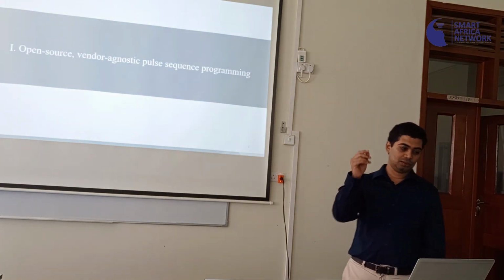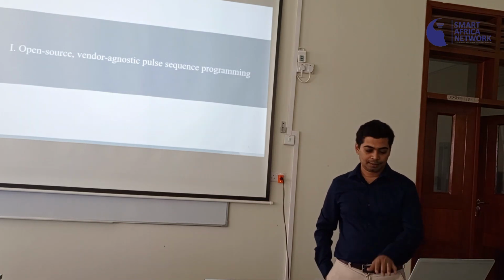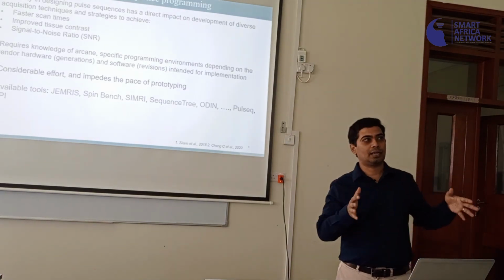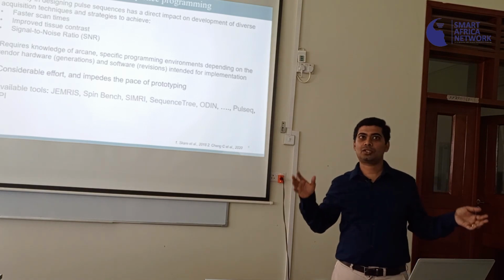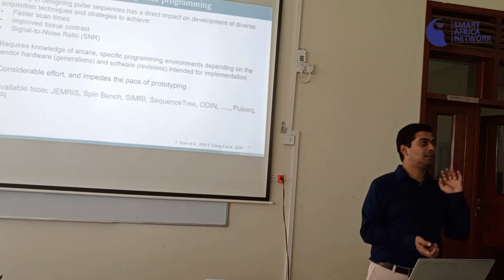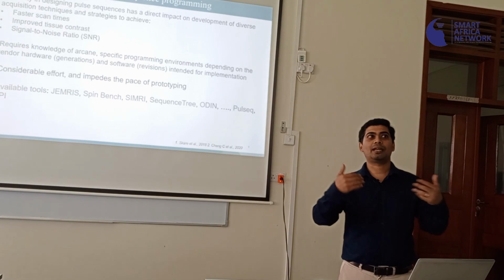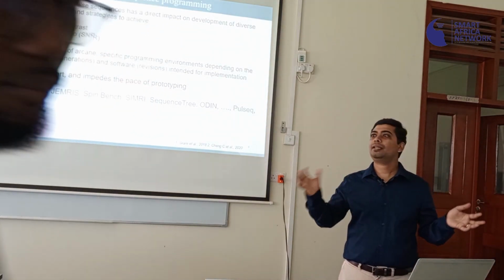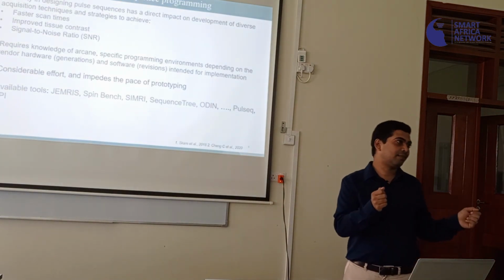Before getting into open source pulse sequence programming, let me tell you what it is about. So once you put the hardware together, I'm guessing some of that has been spoken about yesterday. I saw Tom up on stage, so I'm thinking you have spoken about NdFeB magnets and how you make the magnet array and the 3 coils. If not, I can take a step back and say the MR scanner hardware has 3 kinds of coils, and they all produce different kinds of magnetic fields.